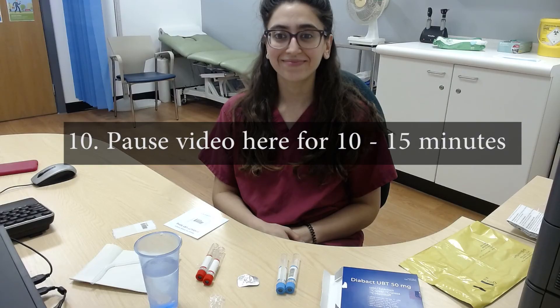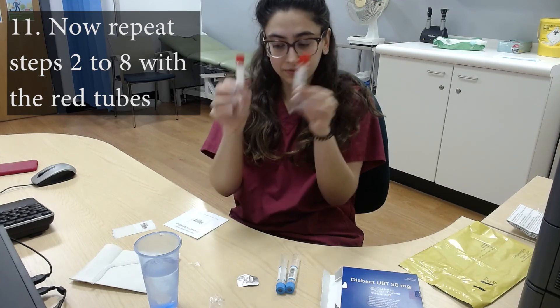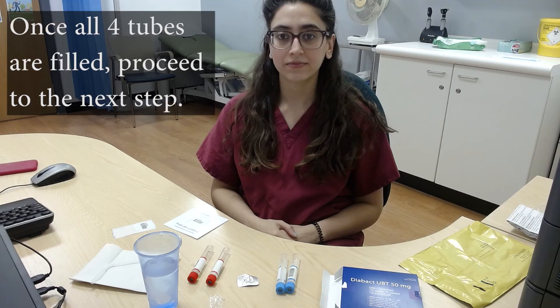You can pause the video here and wait for 10 to 15 minutes. Then repeat steps 2 to 8 with the red tubes. You can rewind the video to step 2. Once all four tubes have been used, proceed to step 12.